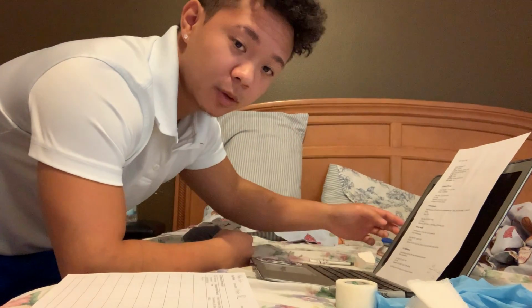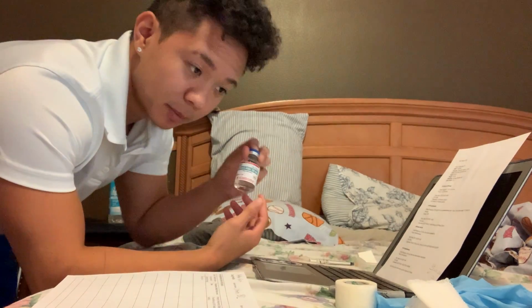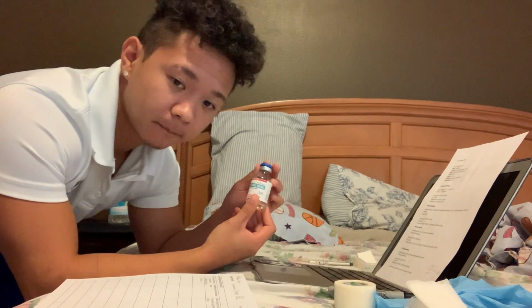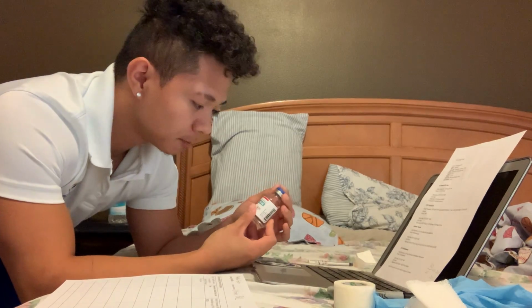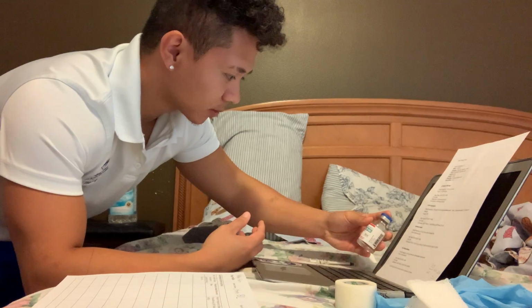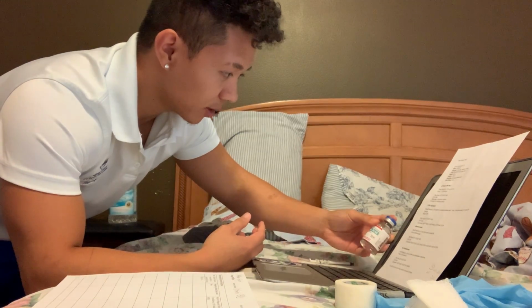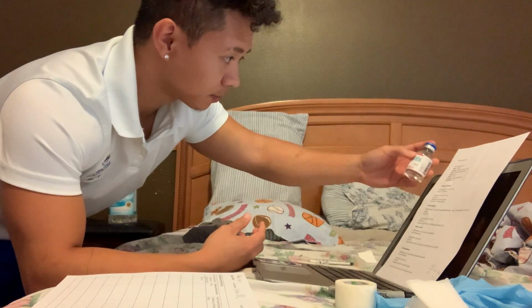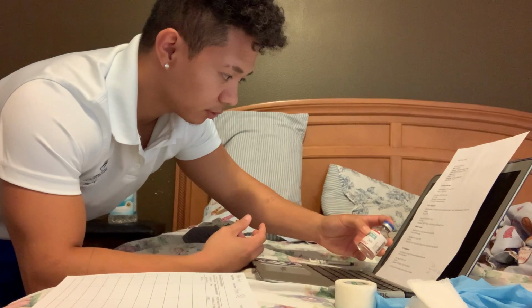So now I'm just gonna pull the medication. So I have vitamin B12, and I'm gonna do my first check of the 5 rights. So I'm gonna compare it to the MAR. The first check is gonna be the right patient, Anna Pawlowski, and then the right drug, vitamin B12.